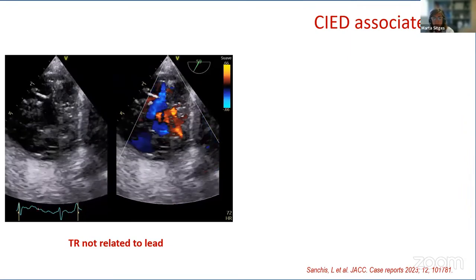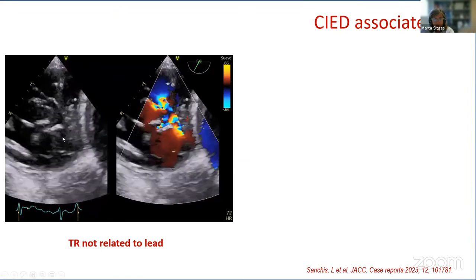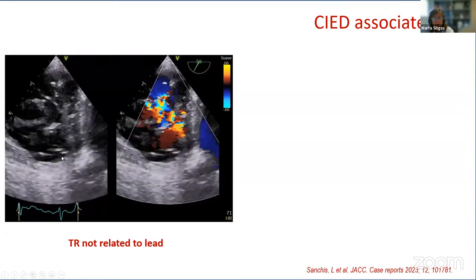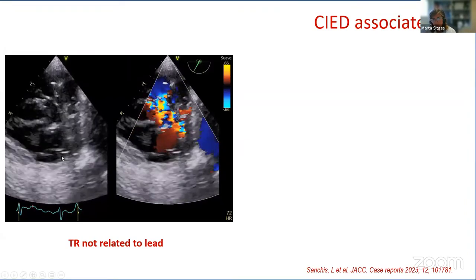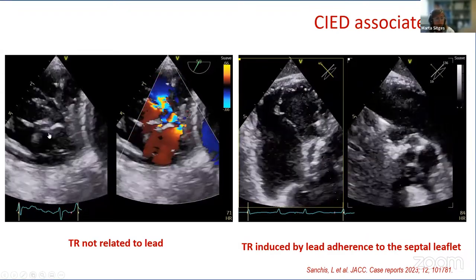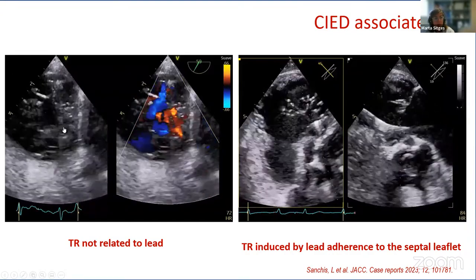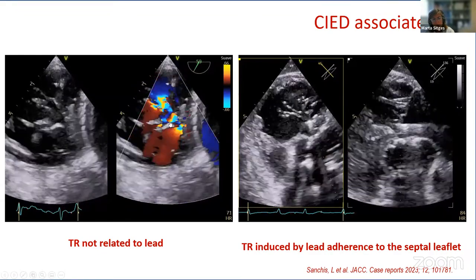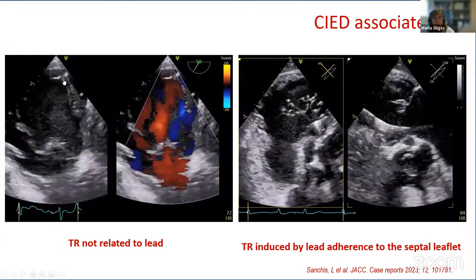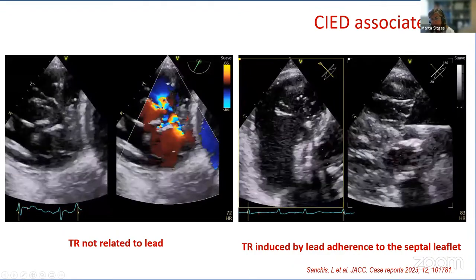Also, a specific chapter for CIED-associated or related tricuspid regurgitation, where imaging is important, particularly echocardiography, and also CT, showing some promise in this sense to understand the involvement of the lead in the production of the tricuspid regurgitation or not. For example, let me show you these two cases where we have two patients with severe tricuspid regurgitation that have leads. This patient had a central origin, as you can see here, of the tricuspid regurgitation, was wearing a pacemaker, but as you can see, the lead was here, very steady in the posterior septal commissure. So probably this lead has nothing to do with the tricuspid regurgitation.